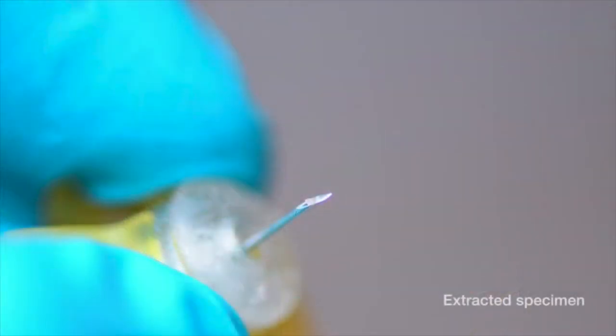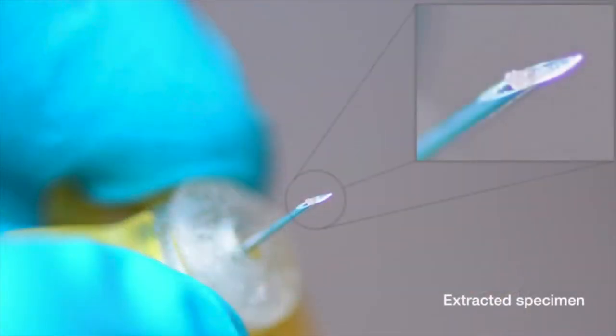After the demonstration, it was confirmed that a biopsy sample was successfully captured.